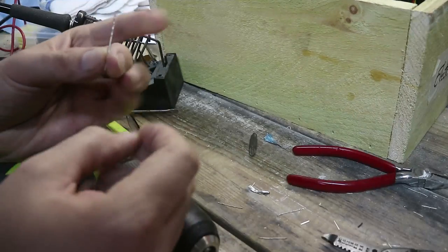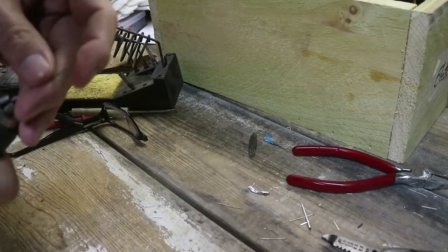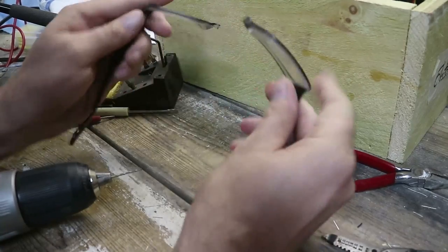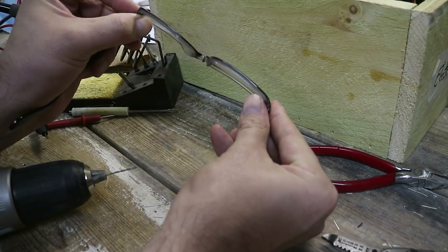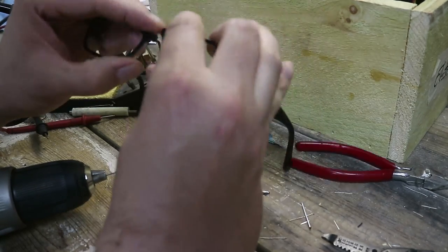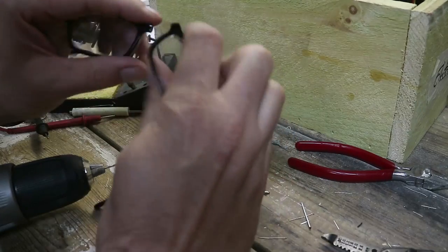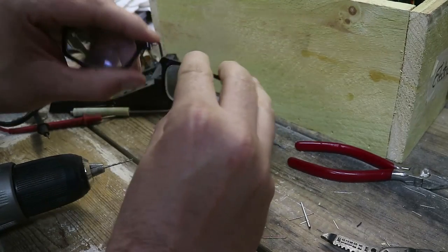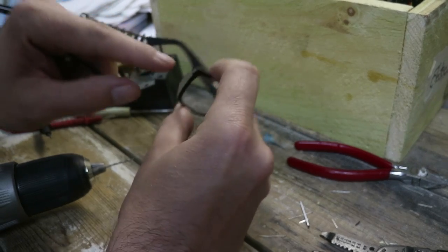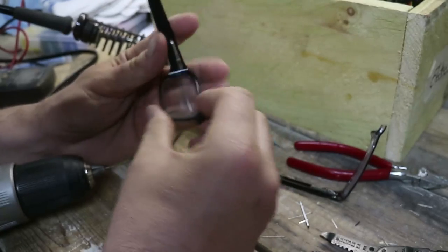So this is my smallest drill bit, seems to be about the right size. When I'm drilling these, the hard part is they don't have to be perfectly drilled this way, because I can put the metal in there bent, but I do need them to be perfectly drilled along this axis so that the two mating halves meet back up. I will file them a little bit so that the glue can fill in, but I do need them to be somewhat even up and down. This way, I'm not so worried about. So I'll drill the short side first, and then we'll go from there.